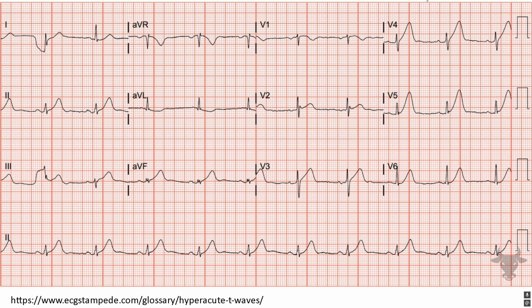For the ST segments, you're looking at the J point, and what you're worried about is J point deviation from the PR segment, T wave inversion, or hyperacute T waves. And then number six, always compare to previous. And again, my definition of a normal EKG is everything on the left is positive except for aVR. On the right, first you go to V3. You want an R wave over three millimeters, and you want the R wave in V2 and V1 to be smaller than that. And then the QRS should be positive in V4 through V6, and you should not have an S wave in V6.